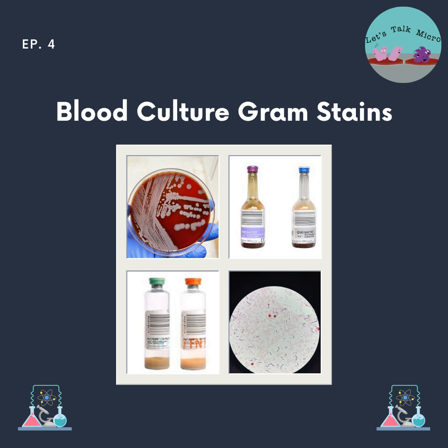So you have your bottle. It has been flagged positive by the instrument, or you see the color change on the incubator. So you need to prepare a slide. So how do you get that blood? Because this is a closed system. So how do you get that blood on the slide? Well, there are some methods out there. You have some devices that you stick on the bottle and they'll let you take out a few drops. Or you can do it with a syringe. You draw some blood from the syringe, you put some drops on the slide, typically a drop or two, and then just spread it. And then you let it dry. Once it is dry, it's ready to stain.